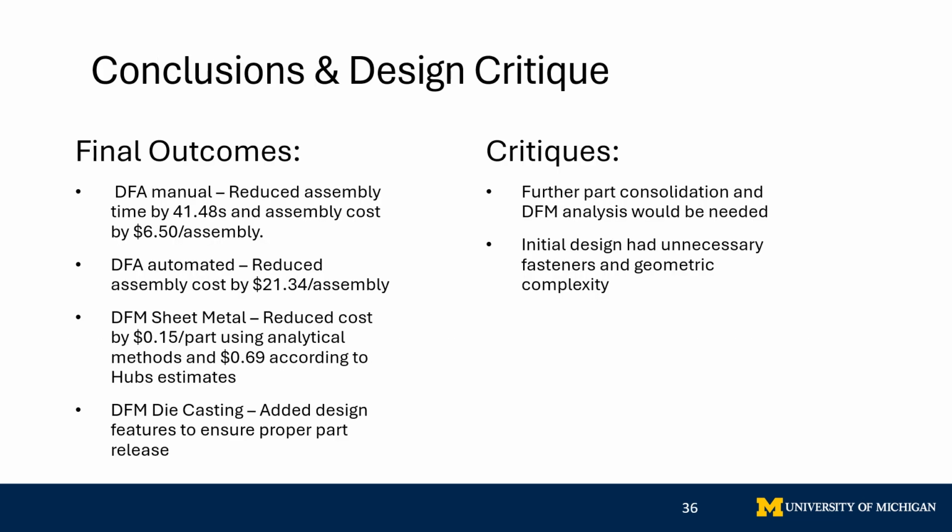The key outcomes of our analysis and redesign efforts for DFA and DFM are summarized on the left. Reflecting on our design, the team recognizes the need for further DFM and part consolidation on the remaining ventilator components. It would have also been beneficial to recognize the unnecessary fasteners and complex geometry of the initial design earlier on in our process.